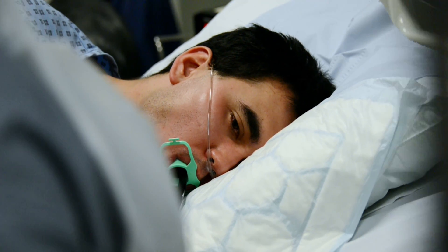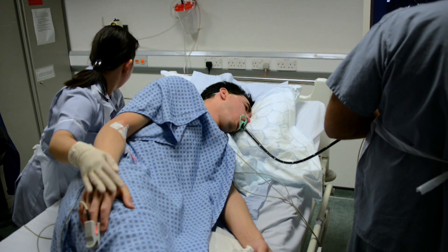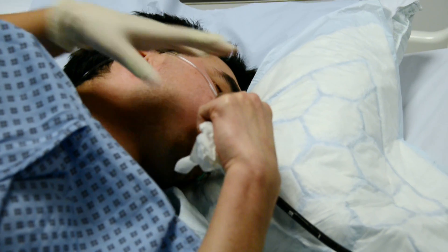The procedure itself, once the probe goes in, usually takes no more than five to ten minutes. The benefits are huge in that you can define what the problem is and plan further management. For the patient, they should not eat or drink four hours before the test.